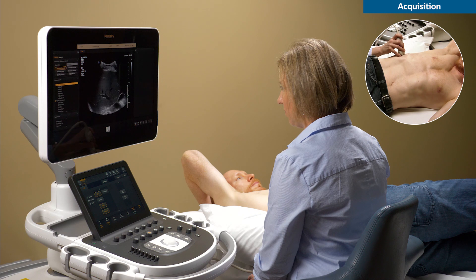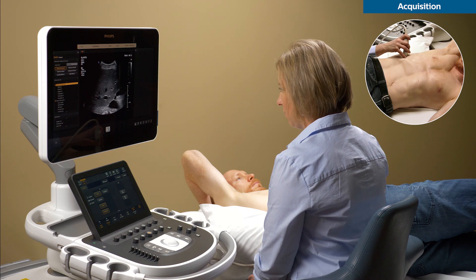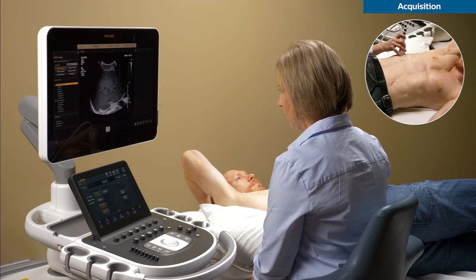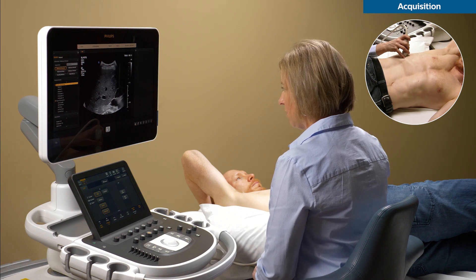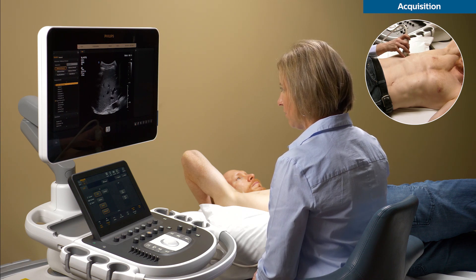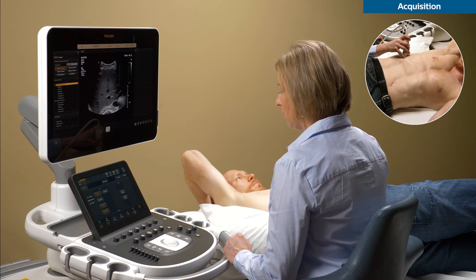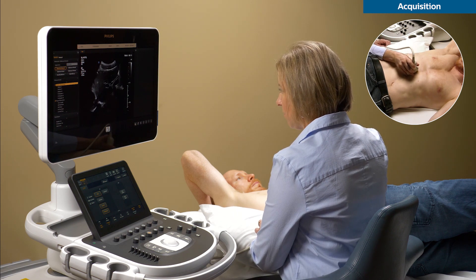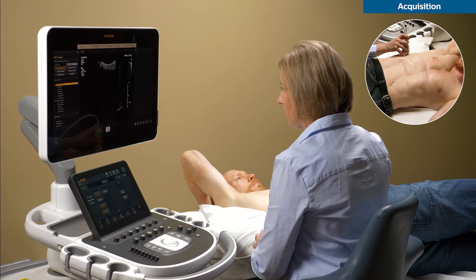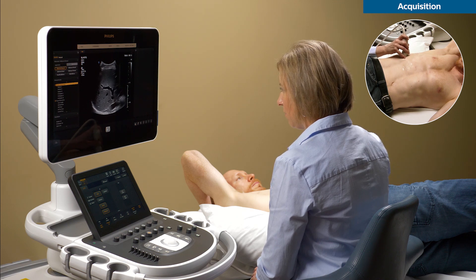For an optimal acquisition, start by finding the segment of the liver where you would like to make your measurements. Ensuring good transducer contact with adequate gel will help. Then position the transducer in the right intercostal space, aligned with the ribs. Image liver segment seven or eight and keep the liver capsule parallel to the transducer surface. We recommend avoiding scanning the left side of the liver as cardiac motion leads to inaccurate results. Look for a section of the liver with fewer vessels and little hypoechogenic structures such as the gallbladder or the bile ducts.